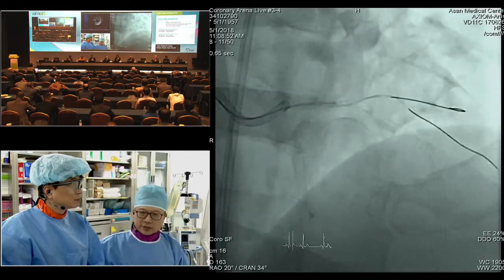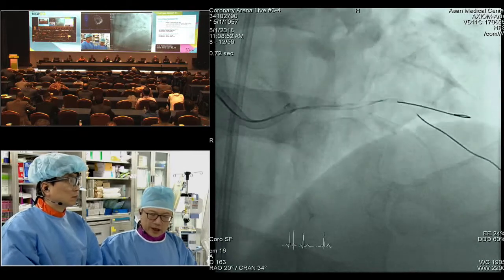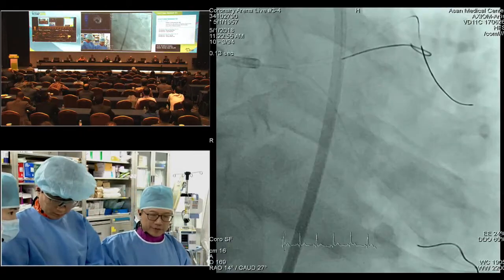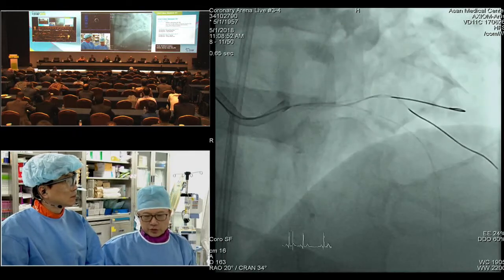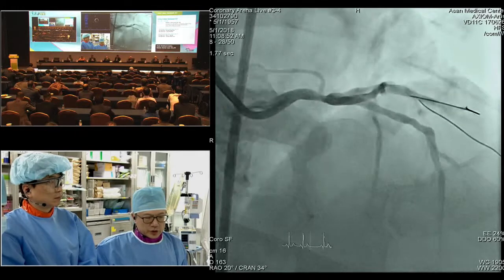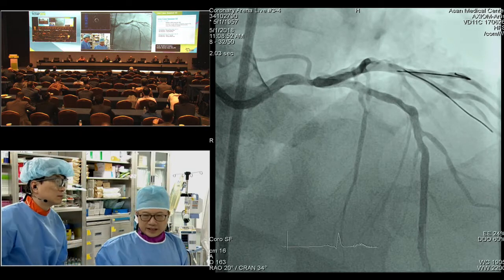Another thing I was thinking about coming over, without seeing the angiogram yet, sometimes we have done this FFR. If we have an FFR open here, we might put the FFR wire in the circumflex and trap it behind the stent, and then do an FFR after we put the stent and be able to tell physiology right away without having to rewire the circumflex, because that's always hard to rewire with an FFR wire. But the wire that we should use is the Boston Scientific wire, probably better because it has the optical sensor for the pressure and has less drift.